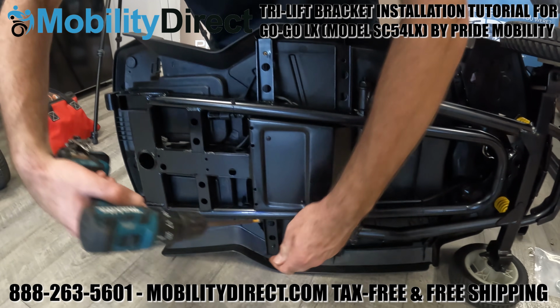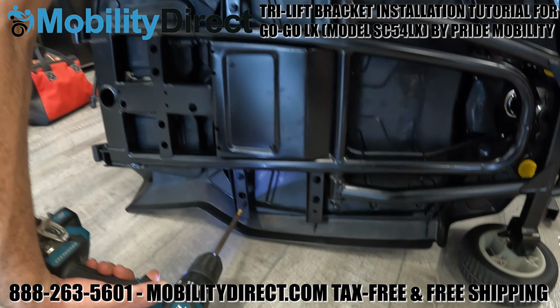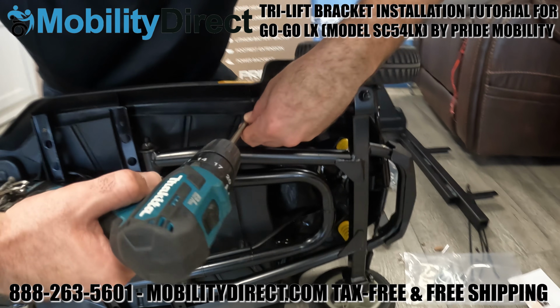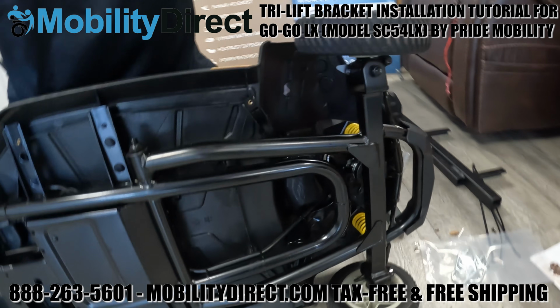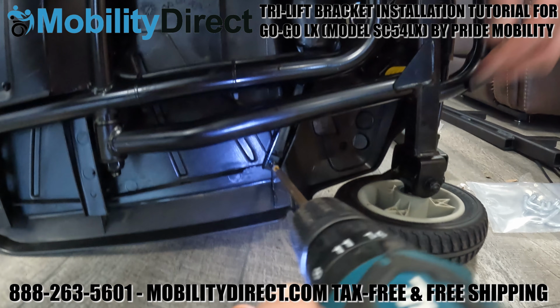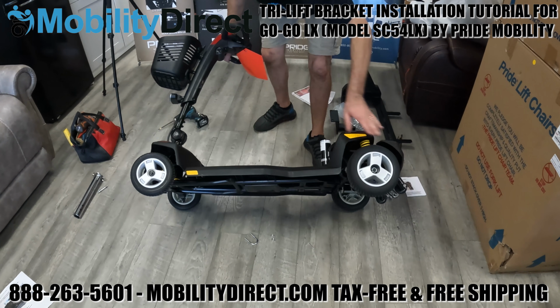So start off with the rear two and then move on to the front two that we're showing you here. And again, make sure to keep your screws handy and don't lose them. Make sure you know which screws are going where when it's time to put everything back together. So keep them organized and keep them to the side. Again, there are four screws that go in through the bottom side of the scooter frame, which are going to be used to completely detach the floorboard from the frame itself.